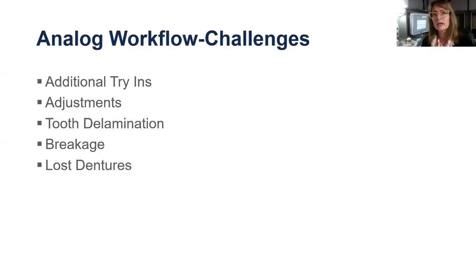And then on occasion, there's some breakage, right? Somebody drops their denture in a porcelain sink, or from a higher level in a shower or a tub, or they lose their denture, or dogs have eaten dentures before. So several different challenges that you eliminate when it comes to digital. Or if you're not eliminating it, you're making the refabrication process much smoother.